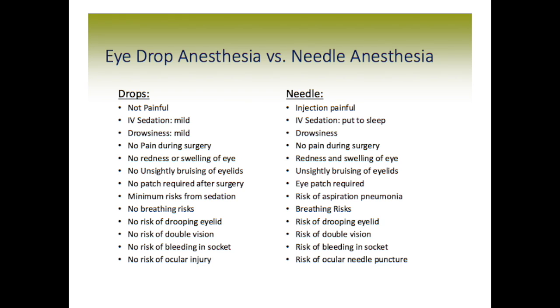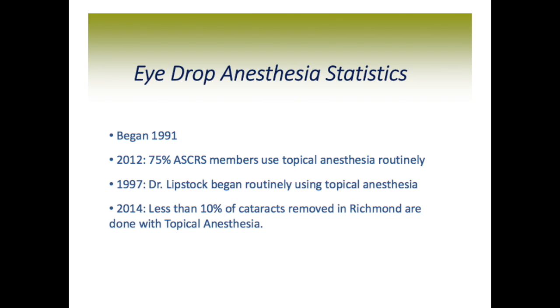And numbing drops are not going to do any ocular injury, but again, with the needle injection, the needle traveling through the socket, sometimes the needle can actually puncture the eye itself and cause a very serious retinal problem. Again, another rare occurrence, but that can happen.